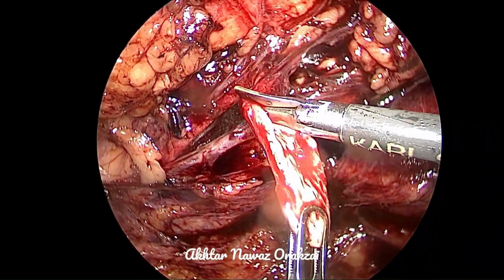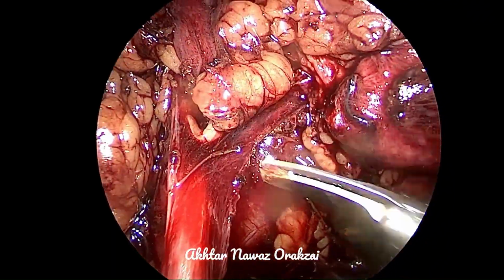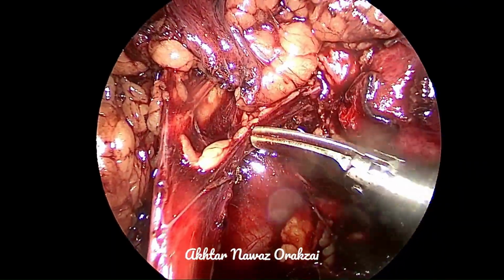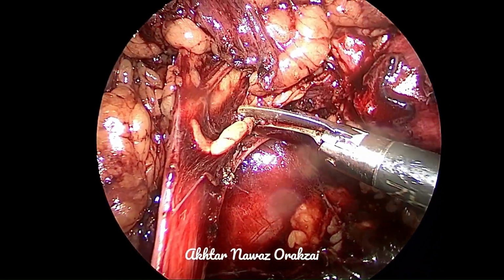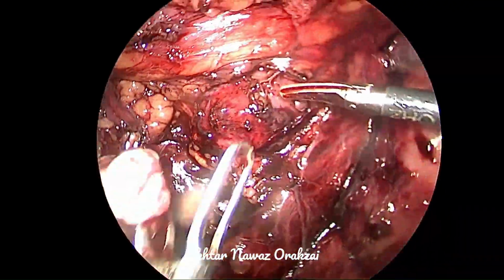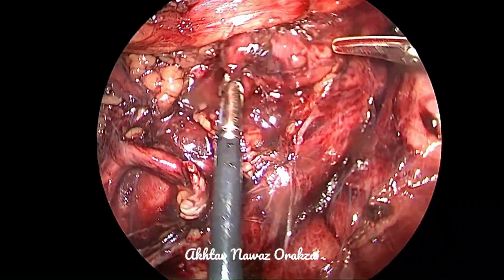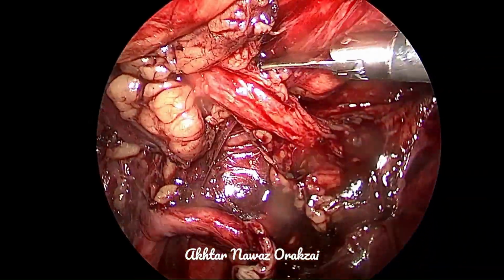So we spatulate a little more because here we don't think that there is any adynamic segment. So we are not excising that pathologic segment. So we spatulate it more towards the normal ureter so that if there is an adynamic segment, that is undone.